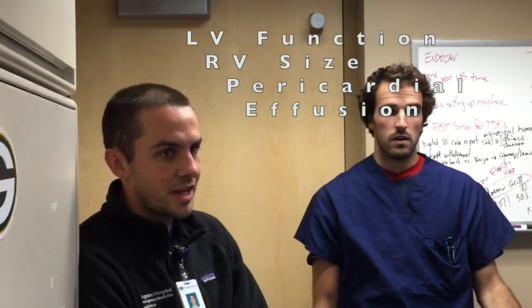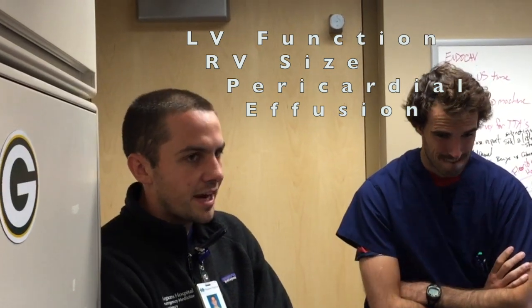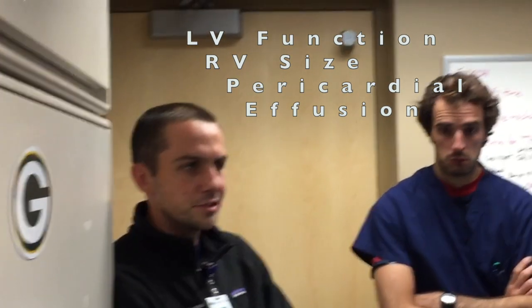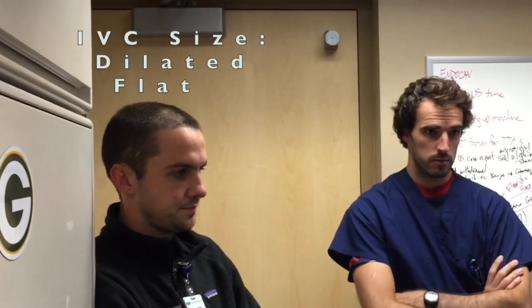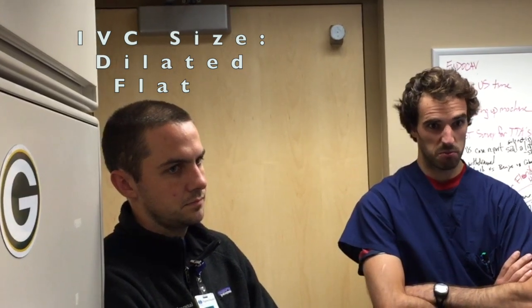What are you looking for with each part of the exam? With the heart, LV squeeze — if it's really poor, that could be the cause of hypotension; if it's hyperdynamic, that could suggest volume depletion; a dilated RV could suggest massive PE; and you might see a pericardial effusion. For IVC — dilated would point more toward congestive heart failure or PE; flat would indicate volume depletion, sepsis, hemorrhage, or dehydration. Morrison's: looking for free fluid that could suggest injury, ectopic pregnancy, or any cause of free fluid in the abdomen. And aorta for triple-A.